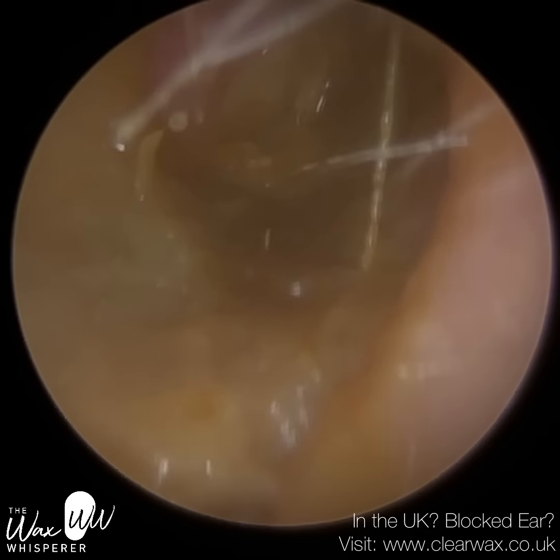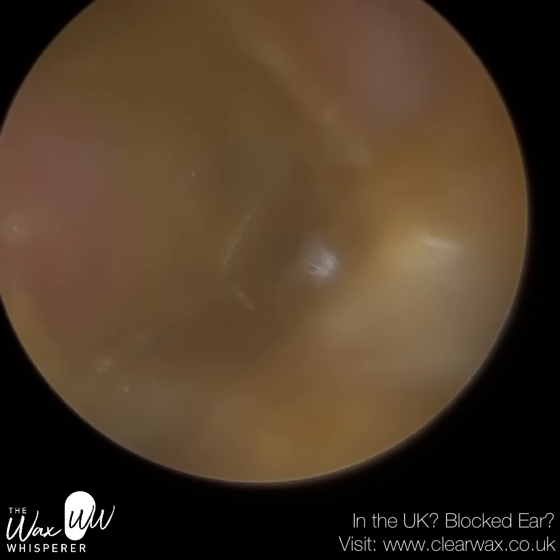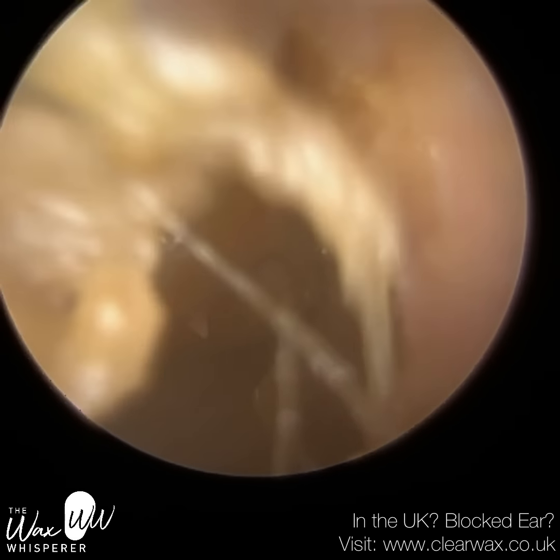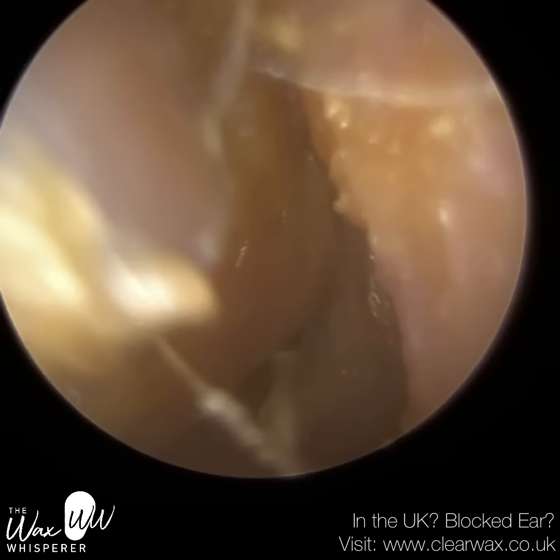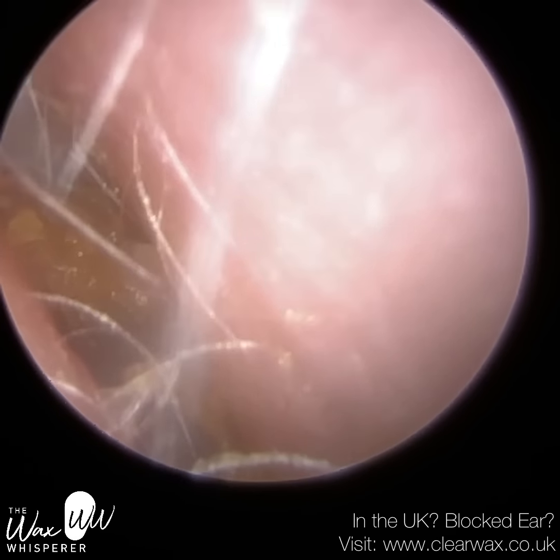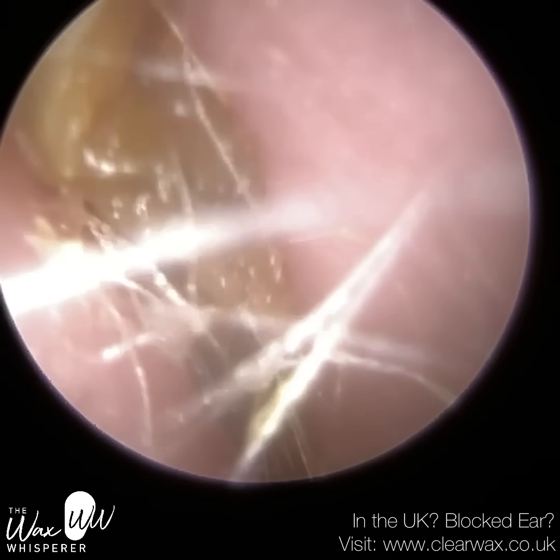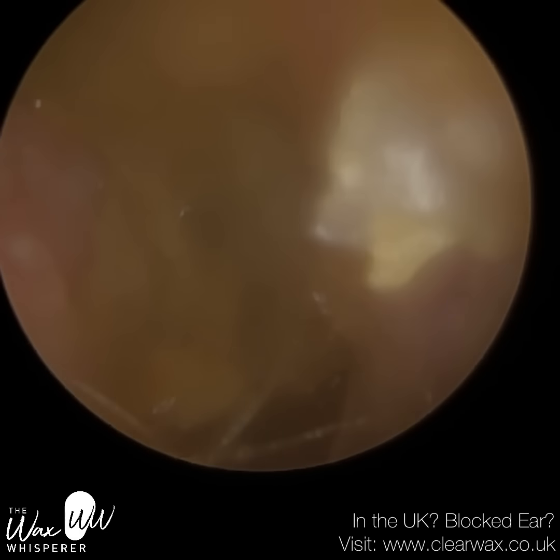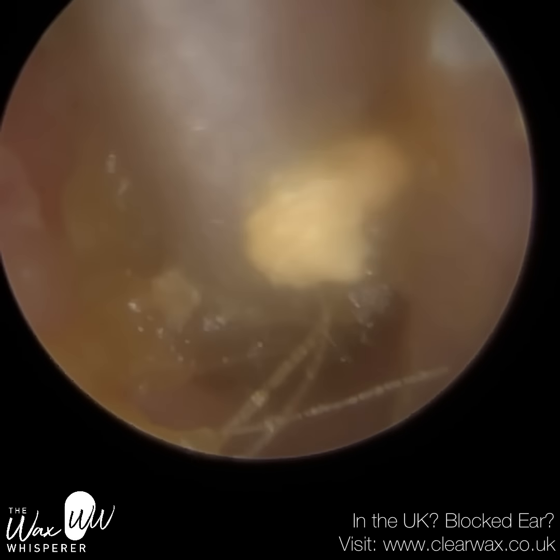This is their right ear — they also got a blockage there, though the left ear was the worst of the two. Again we've got a collapsed ear canal entrance, so I'm just using the endoscope to stretch the ear open and removing this plug from the entrance. You can see how sticky and glutinous and mushy it is. I think I'm going to develop an earwax chart, sort of like a stool chart — medics will know what I'm referring to. It's used by doctors and nurses to assess the consistency of stool to give an indicator of overall health. The name will hopefully come back to me.